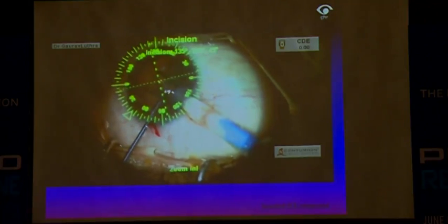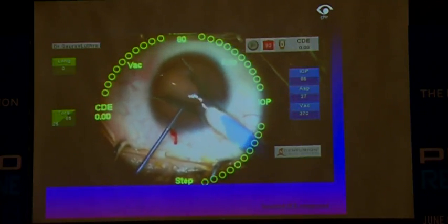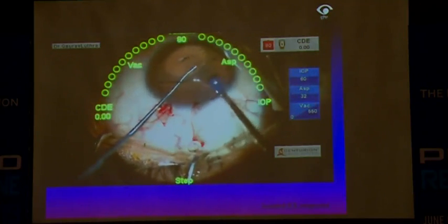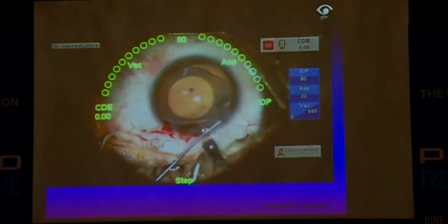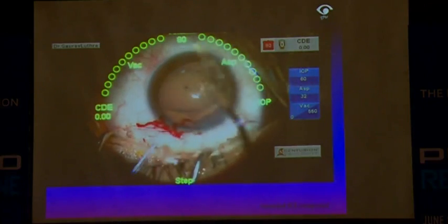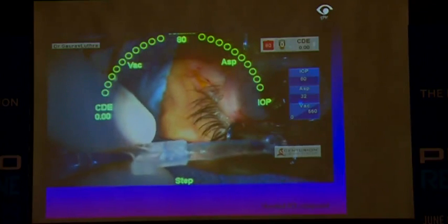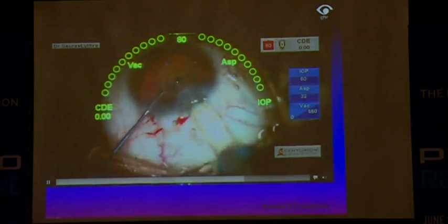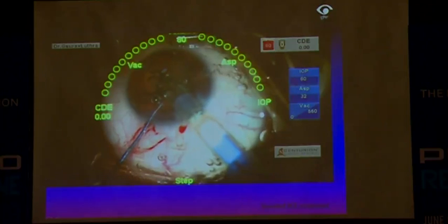And sometimes you will have an ICL which gets inverted during injection. Now that can again be a big issue, because you can see here that in spite of our best efforts, the ICL came out upside down. Then of course, it's not difficult. You don't flip it inside. Just hold one of the haptics. I'll finish this video and we'll be over. You can just hold one of the ears of the ICL and pull on it. It comes out nicely through the 3 millimeter incision. And then of course, you can reload and put it back. It works quite well. And you have to be careful that the injection goes as smoothly as you can.